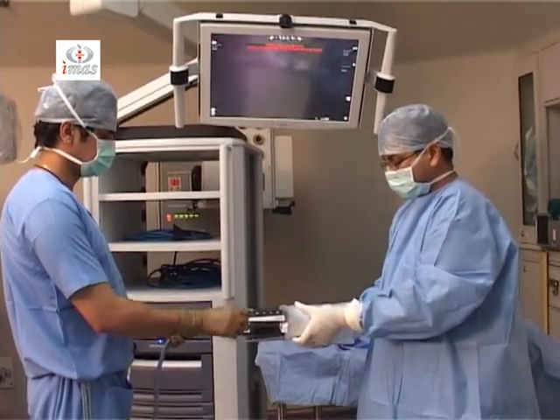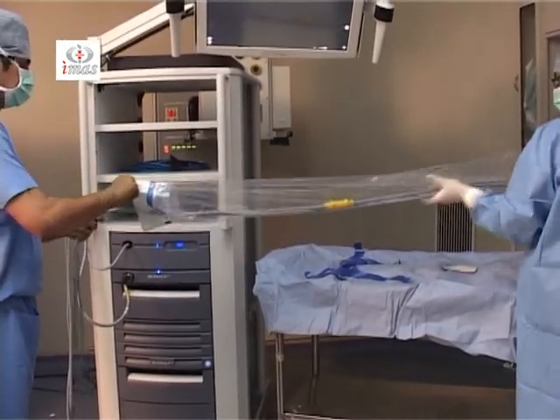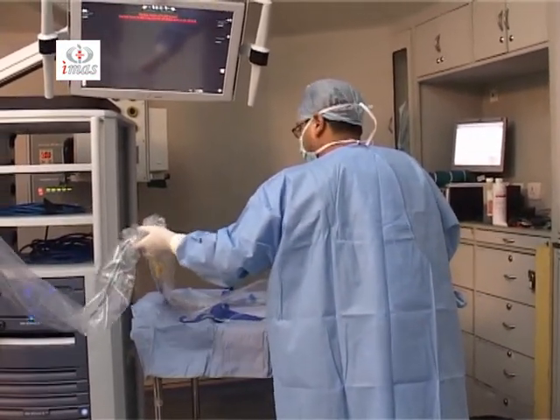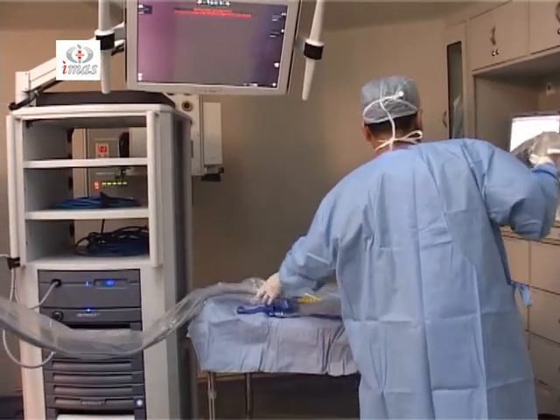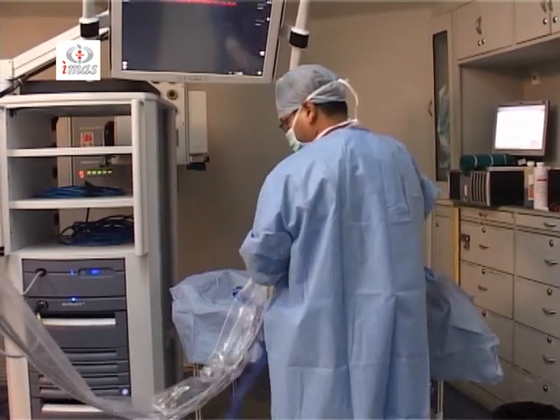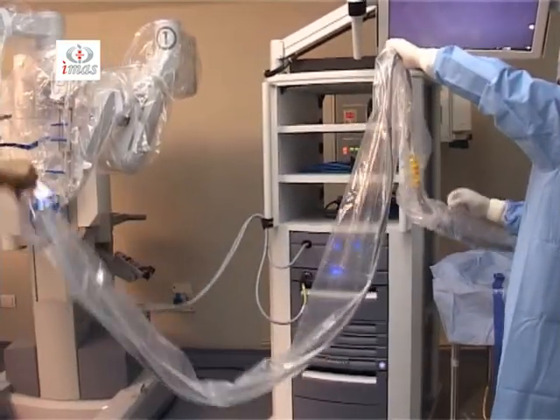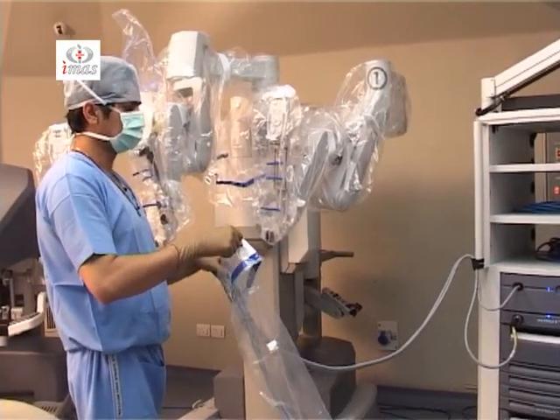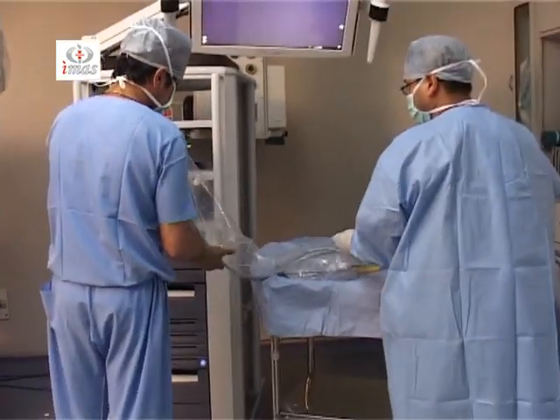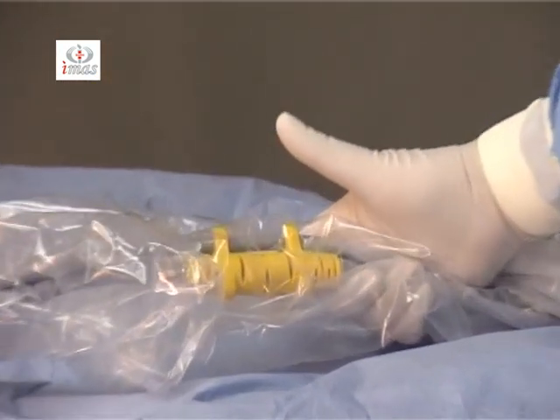This clip has to come by rotating the handle on the camera arm, and we can hold the drape distal to the blue line. And we have to continue gripping the camera arm and putting it onto the body. In an S shape, the camera cable should not bend, otherwise it can break. And this has to be placed on the trolley like this. This is the place where the camera clip on the camera instrument, camera arm is applied.